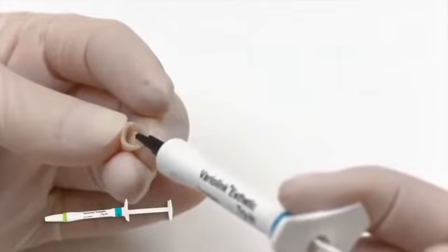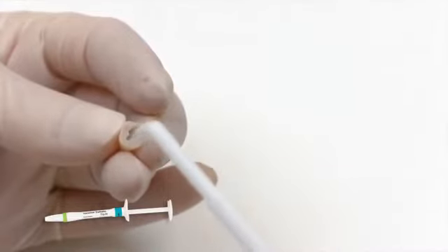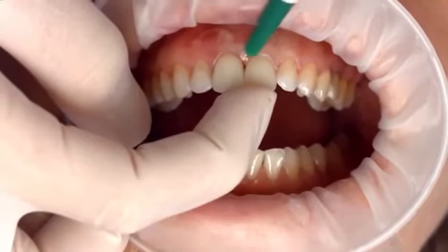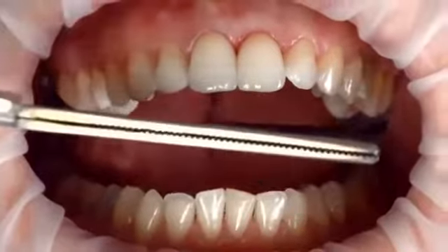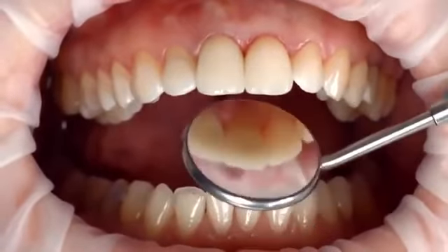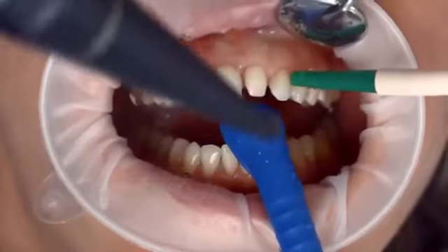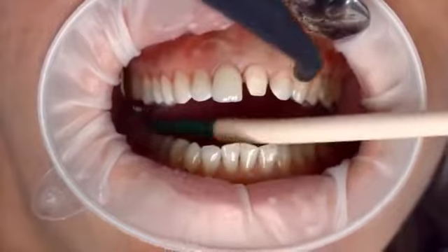For optimum aesthetic results, use Variolink Esthetic try-in pastes to evaluate the shade of the restoration. When trying in the permanent restoration, check the shade effect, accuracy of fit, and occlusion of the restoration. Thoroughly rinse off the try-in paste with water spray after try-in and dry the preparation with water- and oil-free air.